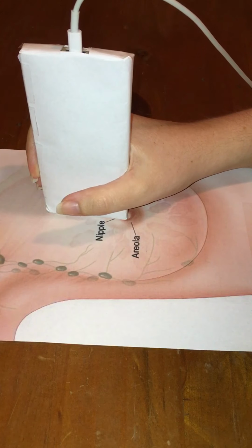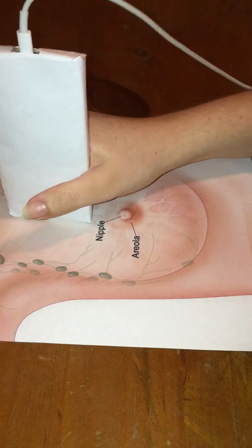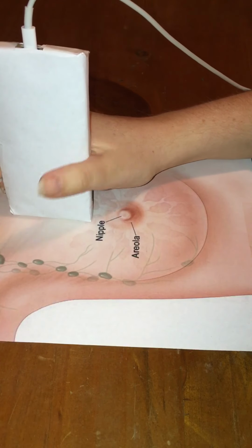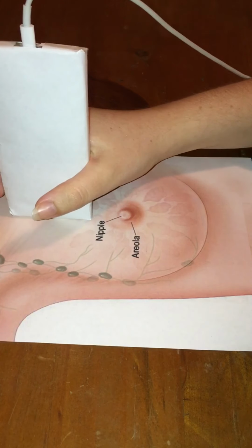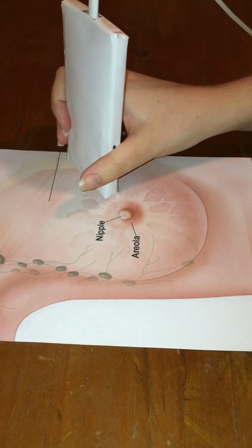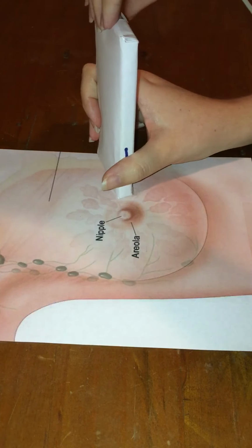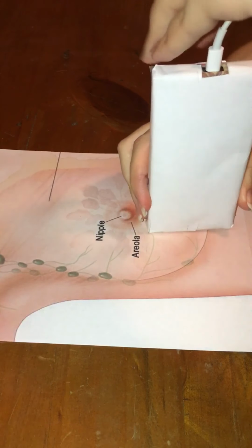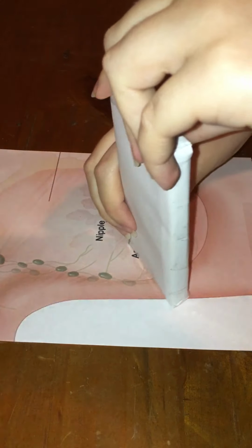After this survey is completed, I place my transducer on the outer breast in 12 o'clock with a marker facing towards the nipple once more. There is overlapping between the inner and outer breast to ensure that all breast tissue is imaged. I repeat the radial survey for the outer breast.